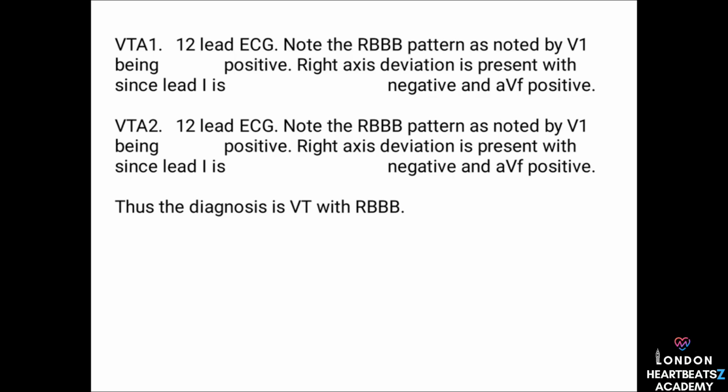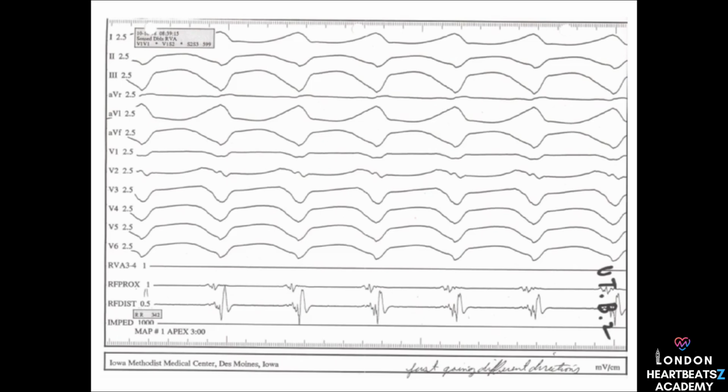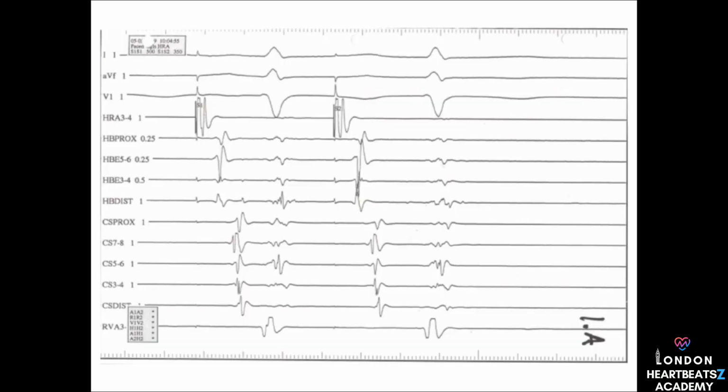Definitely. Okay, now let's look at figures 1A, 1B, 1C, and 1D. These are showing us how we can induce AVNRT using extra stimulus pacing. Extra stimulus pacing, what's that exactly? It's a technique where we deliver an extra electrical impulse to the heart. We're basically giving it a little nudge to see how it responds. So we're kind of poking it to see what happens. Exactly. So figure 1A, we see the intracardiac electrograms with extra stimulus pacing. The basic cycle length is 500 milliseconds, and the S1, S2 interval is 350 milliseconds.